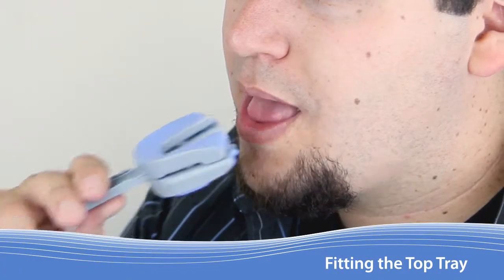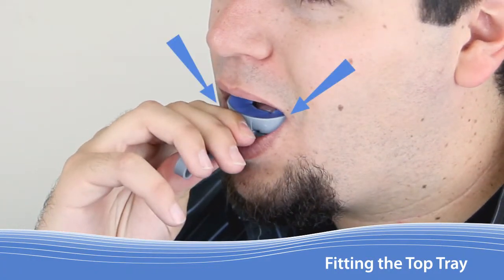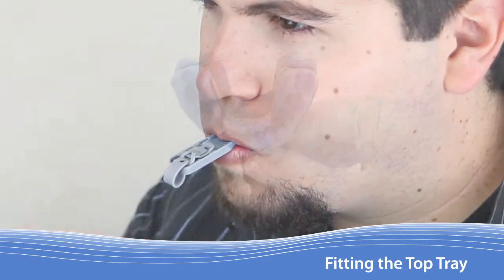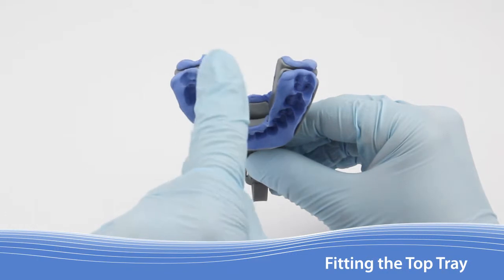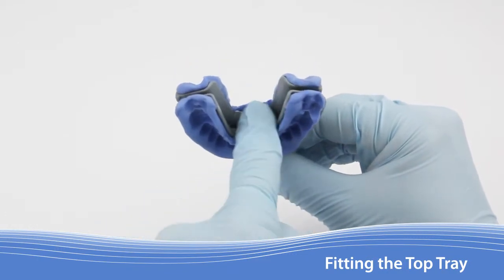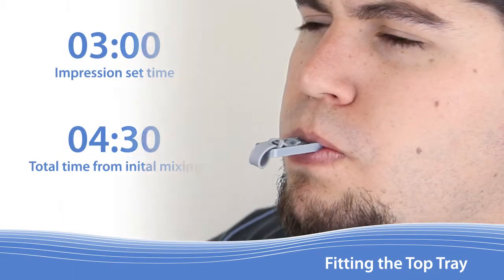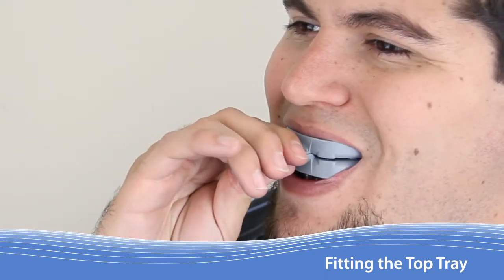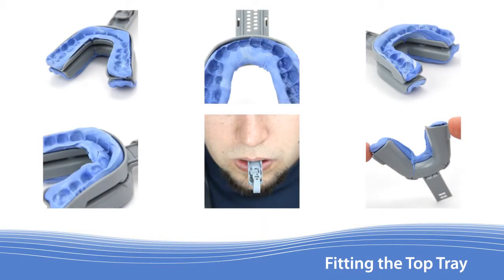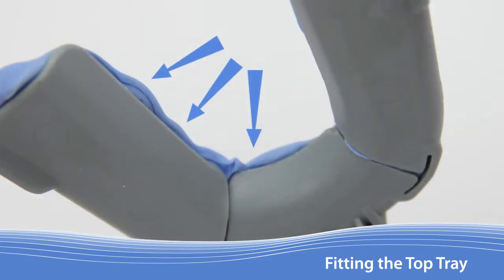To set the retention material for the upper teeth, ask the patient to first insert their teeth into the lower tray, then bite firmly into the upper tray. They should smooth out excess material along the inside edge of the upper tray with their tongue while keeping their jaw as still as possible. After 3 minutes, the patient can remove the appliance for inspection. The same set of conditions applies to the top tray as it did the bottom. A bit of excess material beyond the tray is acceptable.